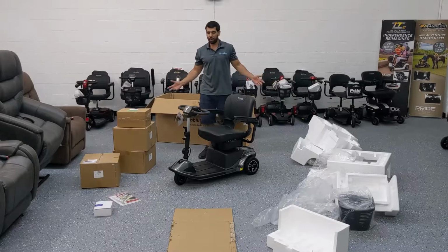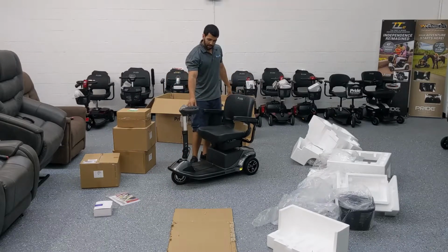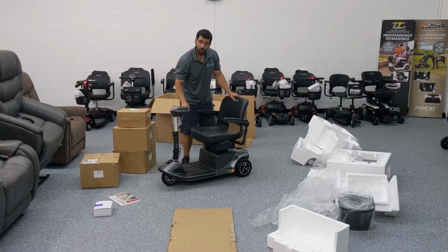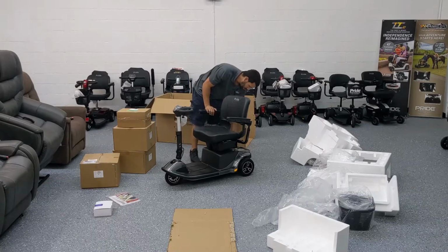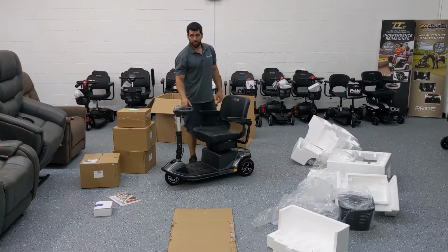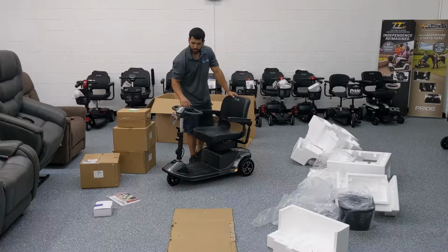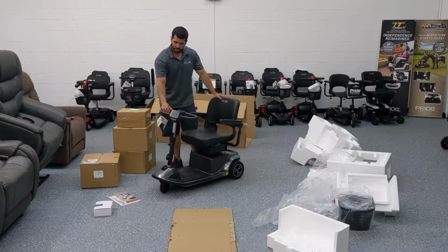What's that? It's beeping. Remember, like I told you earlier, if the scooter is in freewheel mode, it will not work. It's a safety feature. So let's turn it off and put it into drive mode. The yellow switch needs to be in the drive position, and turn it back on. Now it's not beeping, and the scooter goes.